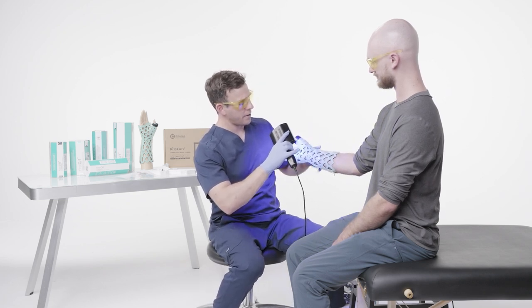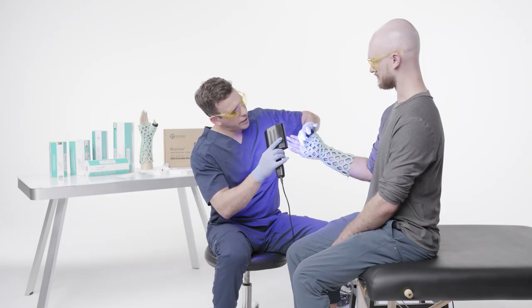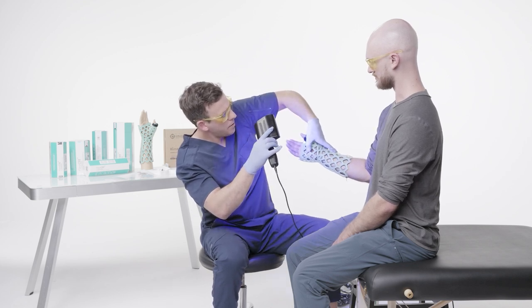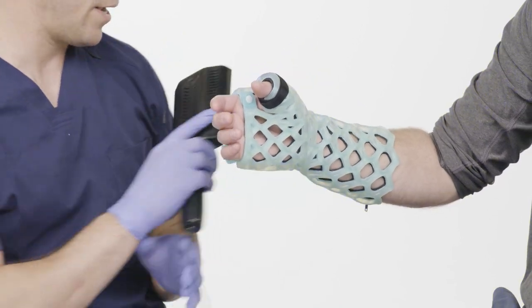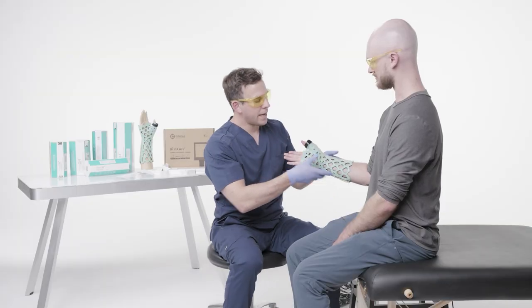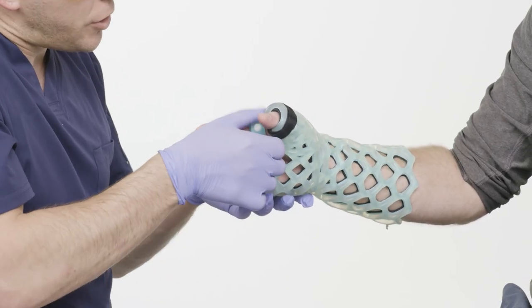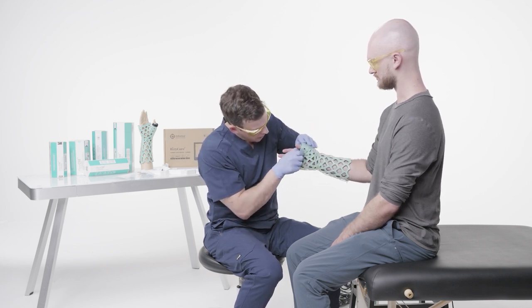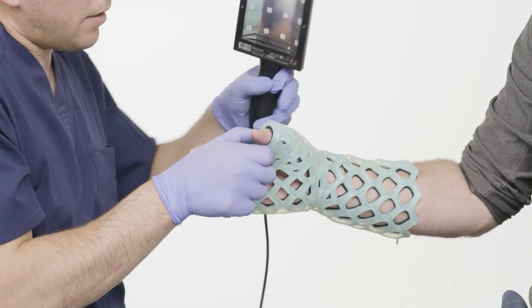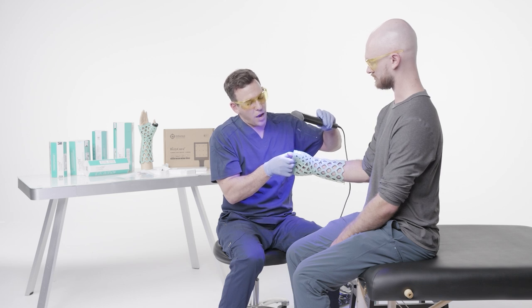I'm going to start making my way up the hand. You want to make sure that you minimize the gapping at the palm crease right there, so I'm going to go ahead and do that one more time. It's completely hardened except for the area where the strap is — the blue light can't penetrate the strap. So I'm going to take this strap off and make sure that area is nice and secure, curing both sides under where the strap was, then restart the light to complete the curing process for that area.